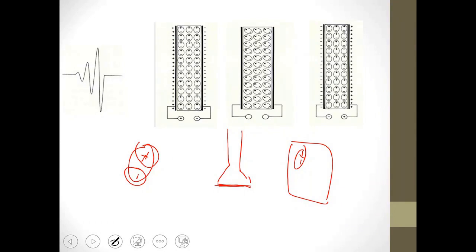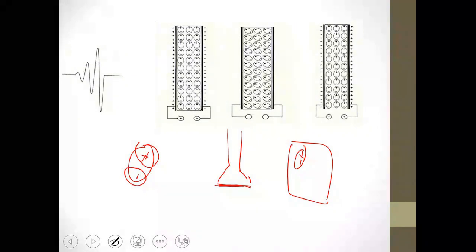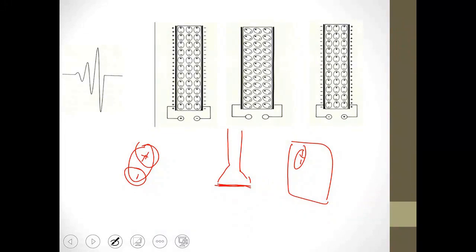At this point, you start using an electric field, meaning you place this crystal between two electrodes, one of which is negative and the other is positive, to begin orientation. For the dipoles, according to the charge of the electrode you placed, the positive dipole will move towards the negative electrode and the negative will move towards the positive electrode. All right, so you did this orientation.